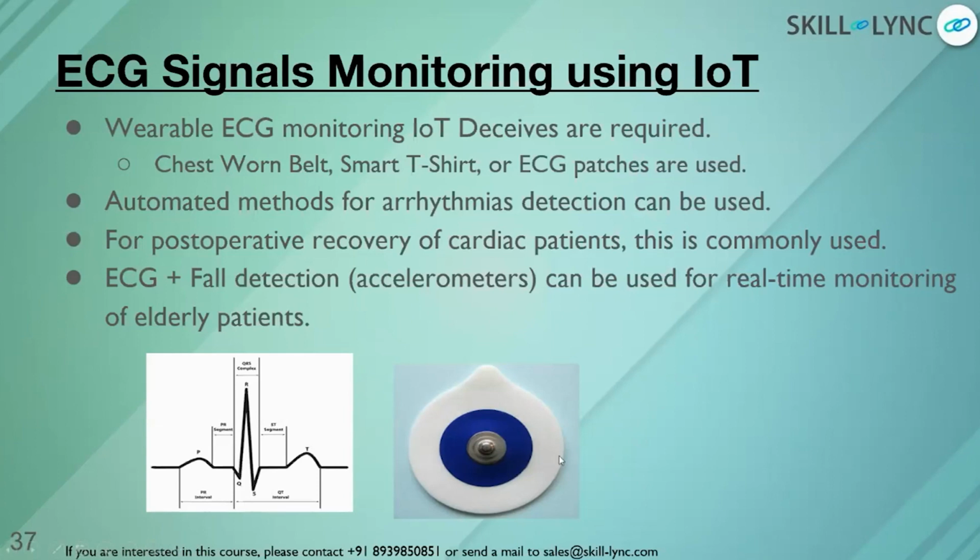If it is continuous monitoring or a wearable ECG system, then we will not use these electrodes, guys. You need specialized electrodes called dry electrodes. Why, I will tell you. If you see these electrodes, there is a gel placed inside them. I think most of us would know that the gel is used for resistance matching. It will make signals easily go to your device. When you use the gel, some itching may happen. Correct. That particular gel can dry off.